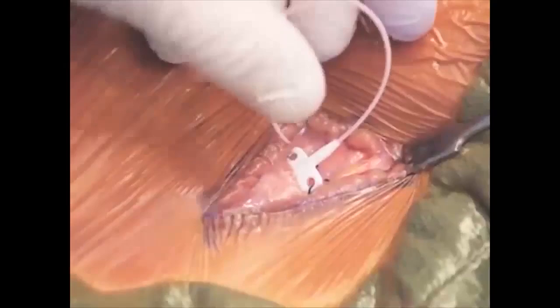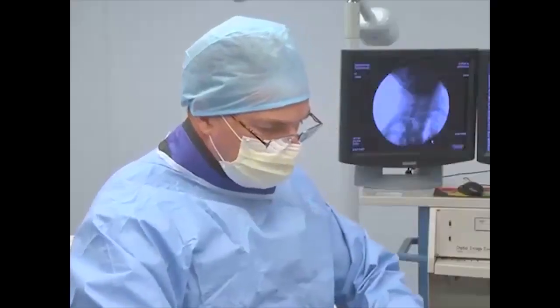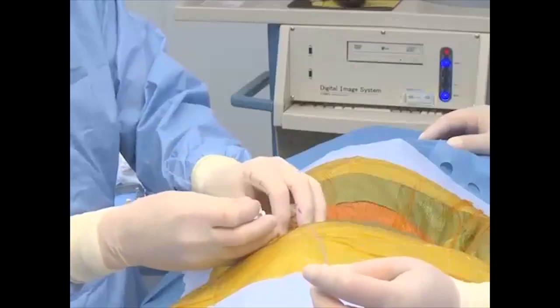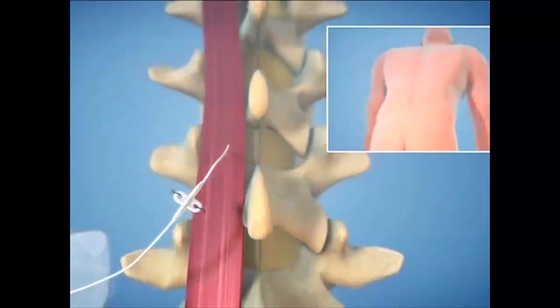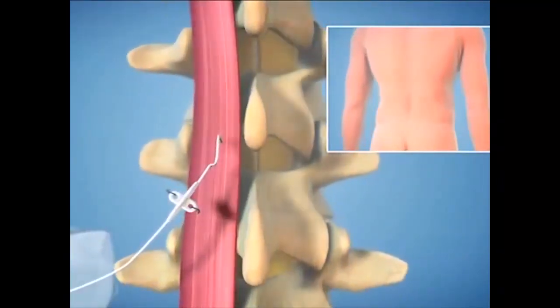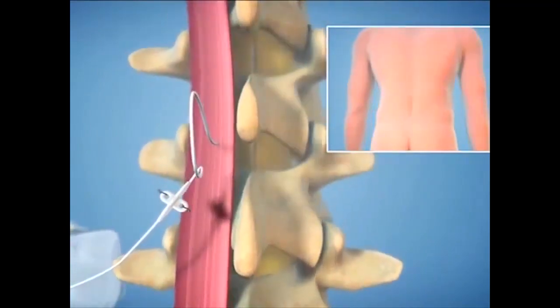Clinical studies and surveys indicate that the rate of catheter-related complications associated with intrathecal drug delivery may be reduced by following specific surgical methods. The purpose of this segment is to demonstrate catheter complications that can occur and recommend methods that may lead to lower complication rates.